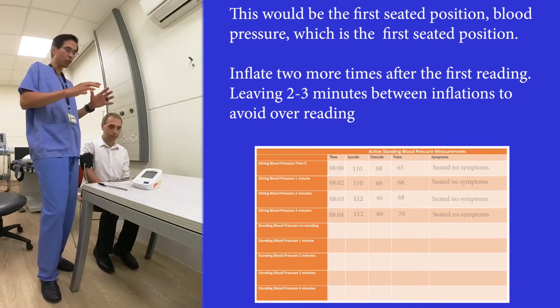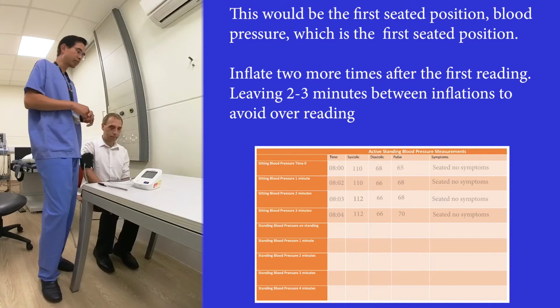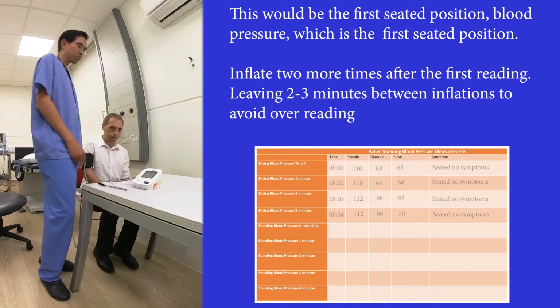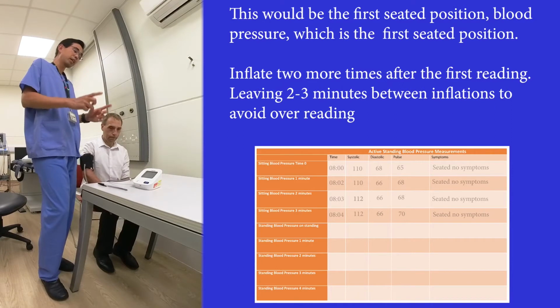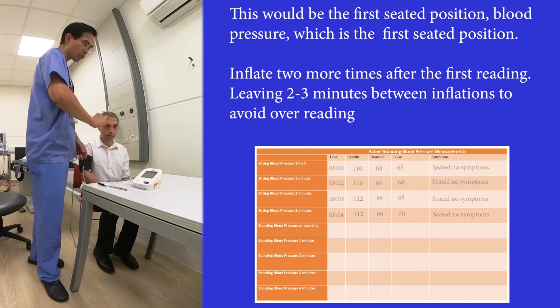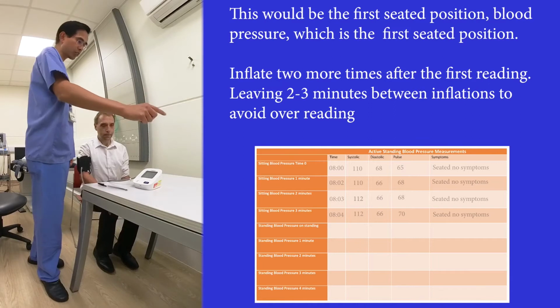This is also a way to get yourself nice and calm, with slow breathing, not really doing much, with somebody pressing the buttons. Ideally not you, but if you have to do it, if you're alone at home, then you just simply reach out and press the start-stop button and write down these values as they appear live. Now, the next bit of the procedure: assume we've done 3 or 5 of these. We've written the lines and we've said seated 1, seated 2, seated 3.